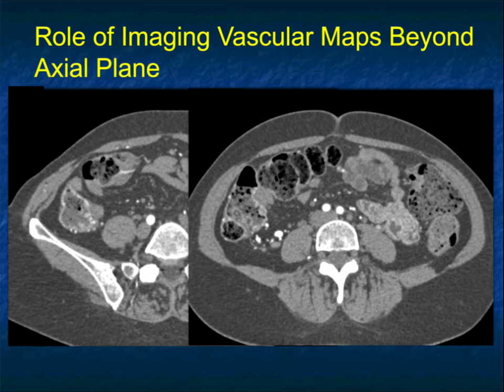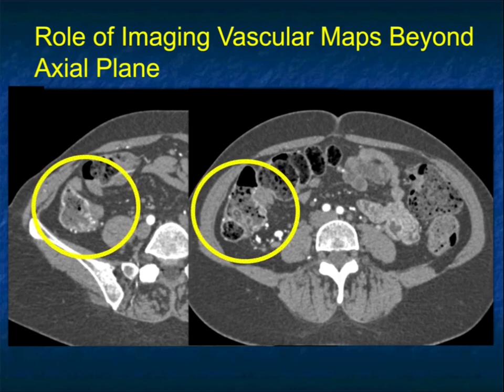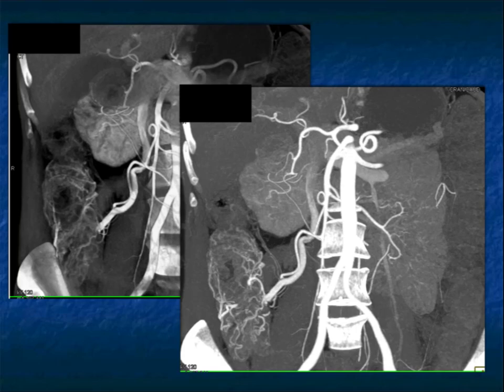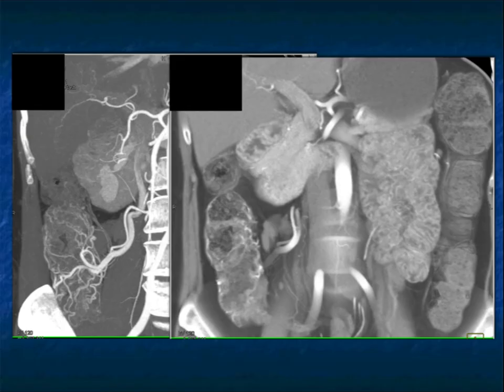It's very important to do reconstructions including MIP imaging when you're looking at bowel. Here's a good example: a patient with GI bleed, initially read as negative. If you look at the cecum carefully, it looks like there's more enhancement than there should be. But on a coronal MIP image, look at those prominent vessels, the vessel tortuosity, and that feeding ileocolic vessel — beautifully shown. This was angiodysplasia, the source of bleeding, and eventually it was resected. On slices alone, even in the coronal view, you can't appreciate it, but you really can on MIP imaging.